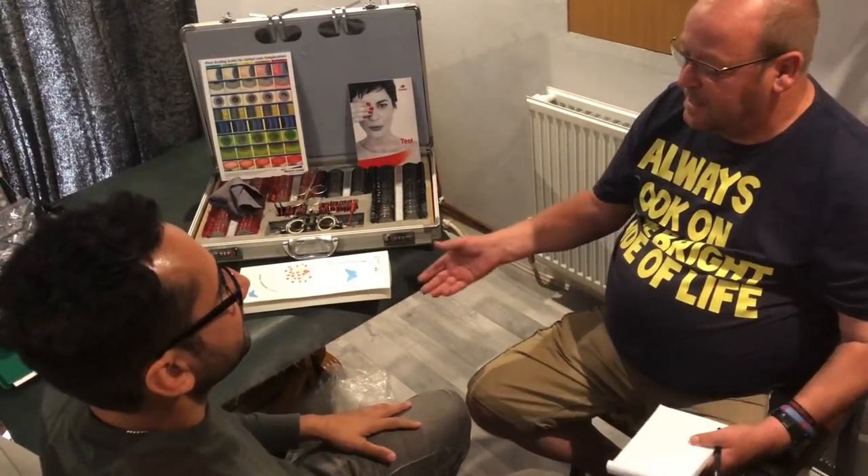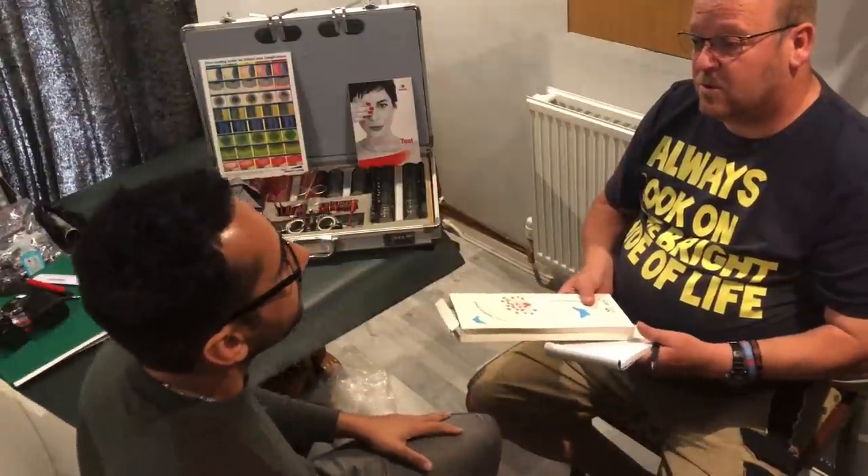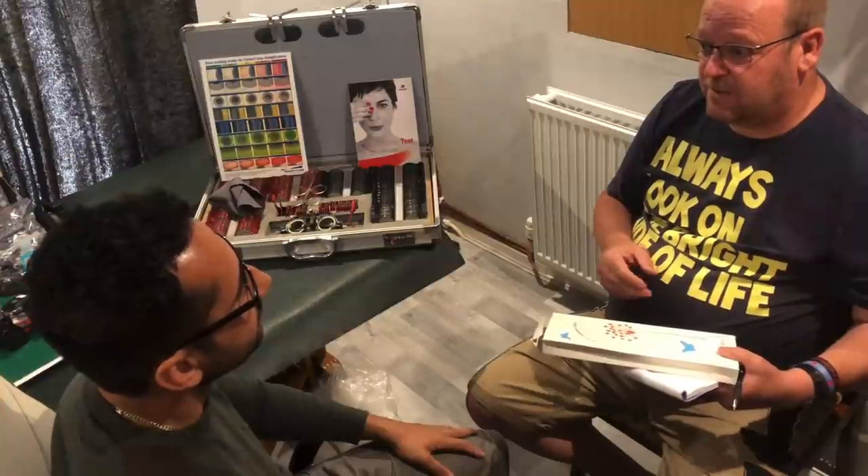Hello. Alright, so now as you've got your first pair of glasses, I know that you want to have a tint on your spectacles, so I'm going to go through a few examples of what we can do for you.